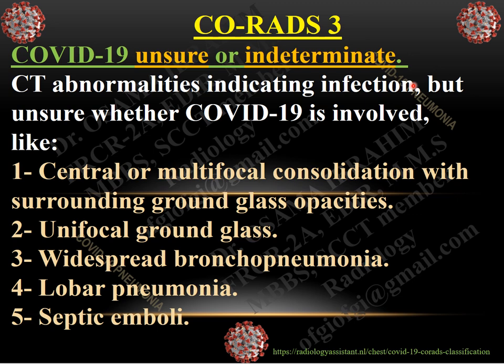Now, we're going to talk about CO-RADS 3. COVID-19 is unsure or indeterminate if we classify the CO-RADS as grade 3. The CT abnormalities indicate infection, but it is unsure whether COVID-19 is involved. What are the findings we see in the CT?